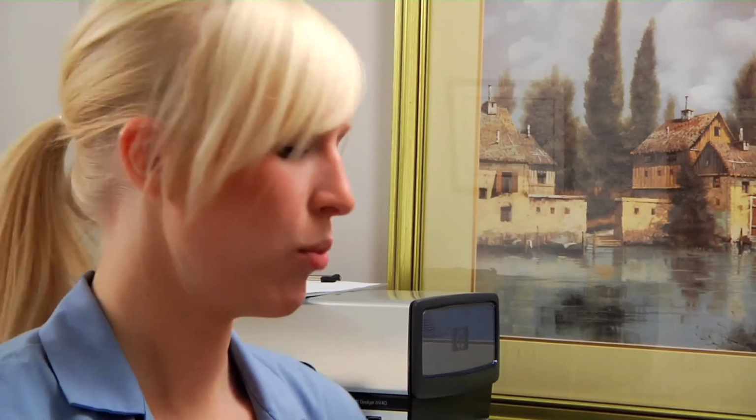Tell them, I'm going to put the blood pressure cuff on you, leave the room for a few minutes, and turn the lights out. I want you to relax, breathe deeply, and keep your legs uncrossed. Those are 3 very important things that the patient really needs to do in order to make sure their blood pressure is a nice resting blood pressure.